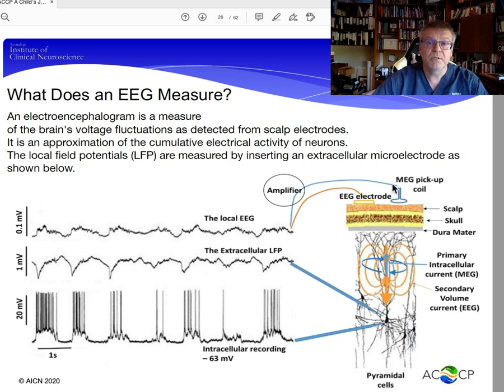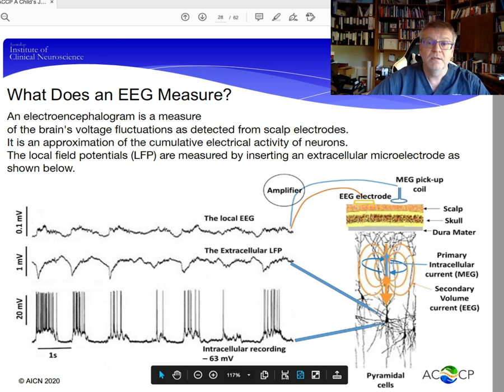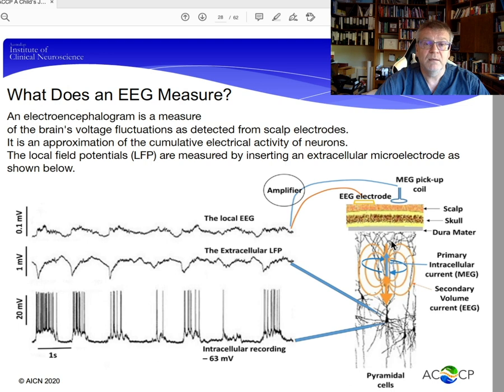Now, this is just a diagram demonstrating what we're actually measuring with the EEG. Those blue and red and green areas on the head maps represent activity of these neurons. Basically the pyramidal neurons in the cortex, and each electrode is probably picking up between 4 and 10,000 neurons, depending on where in the cortex it is placed.